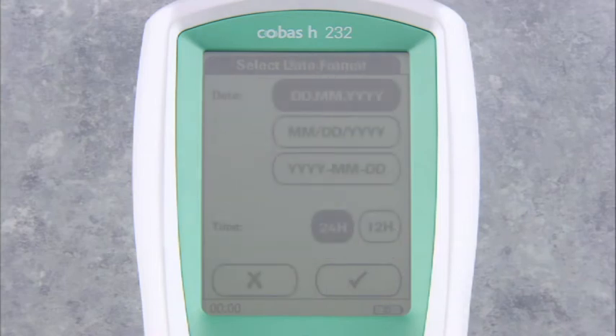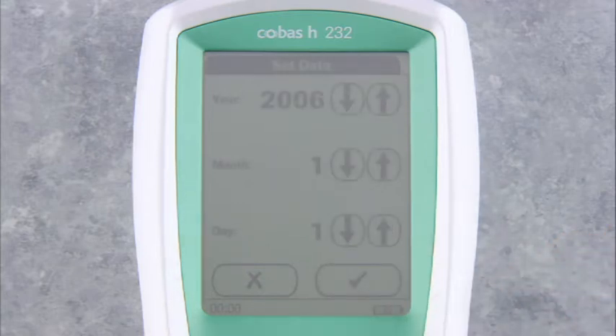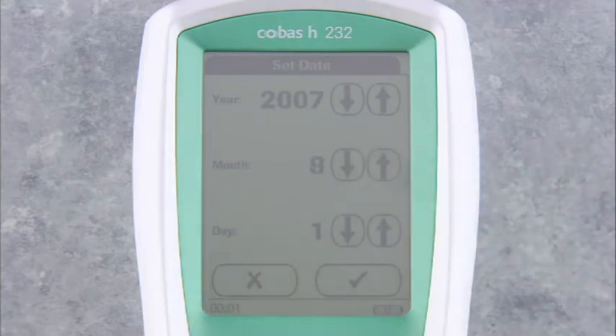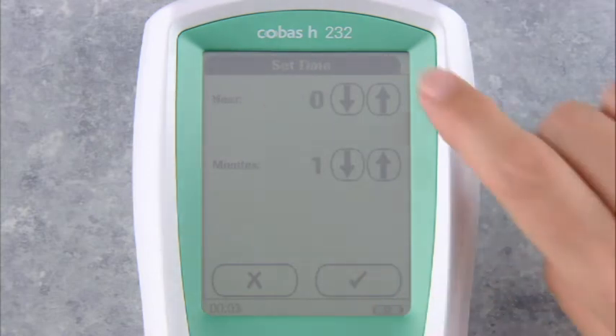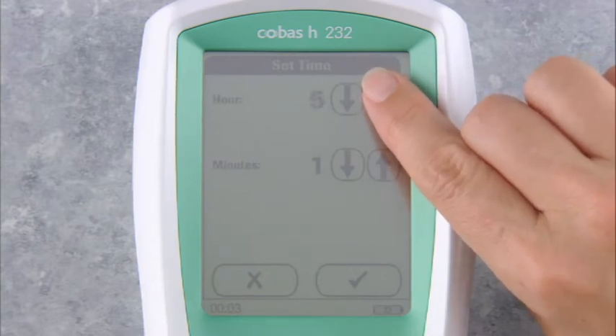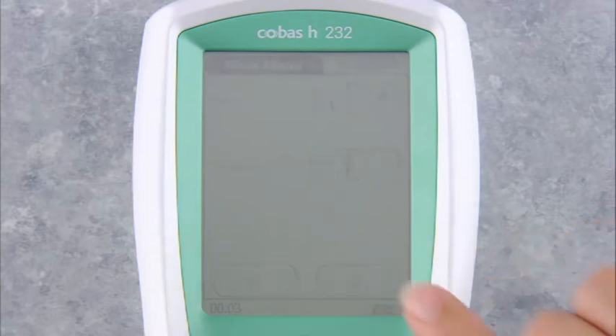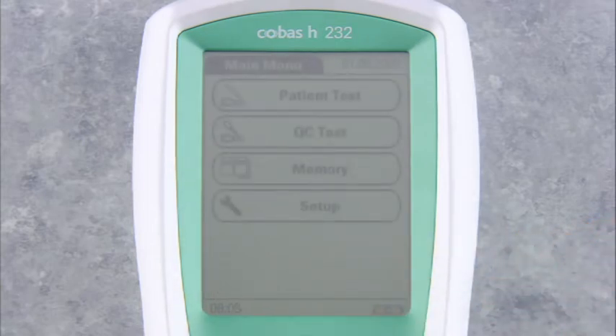The date format menu automatically appears. Set both the desired date and time formats by selecting the appropriate buttons and touch the check mark to accept. The set date menu automatically appears — set the year, month, and day using the arrow keys, then touch the check mark to accept the date and move on to the time. The time menu appears; set the hour and minutes using the arrow keys. Touch the check mark to accept the time. The main menu appears and the meter is ready to run a test.